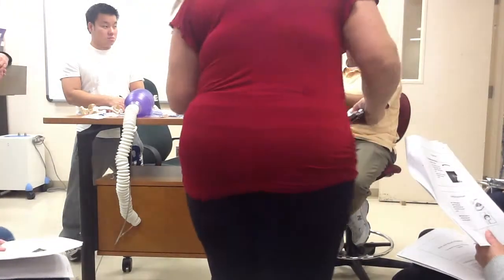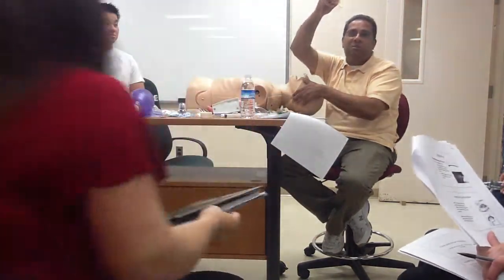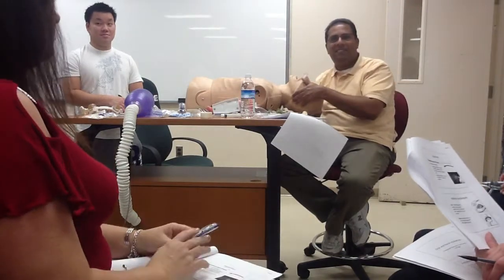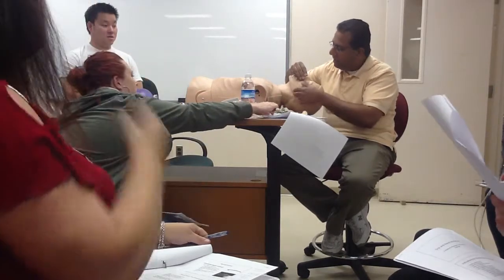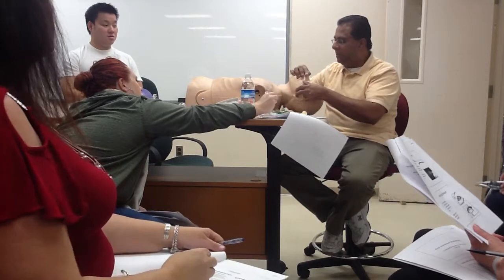Because it's on the tip of the nose. Come on, guys. The first one was better. John's saying this is better. That'll be more tolerated by the patient. Not the first one. Which one? This one? Well, it's a little small diameter-wise, but length-wise it would be tolerated best. But it's not long enough. It's going to the nostril and it's not long enough.